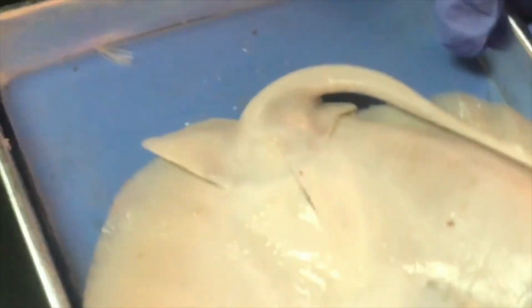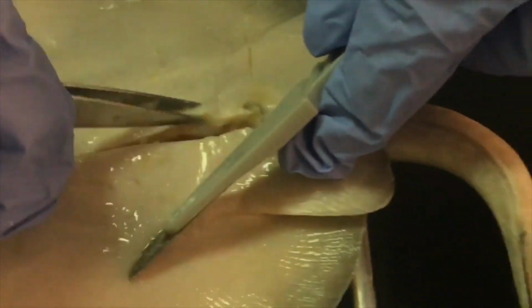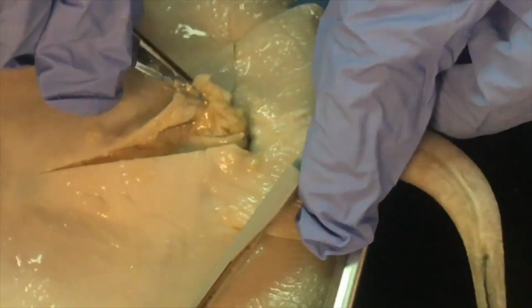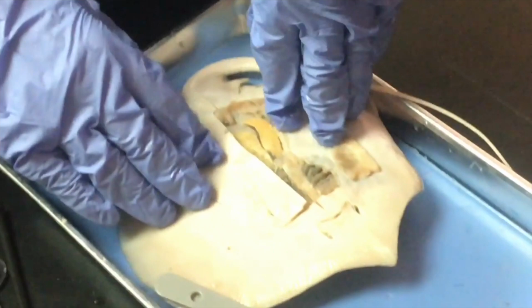Trying to squirt, but it can't really. Enough through the skin. Trying to get the... There we go. Okay. Ooh, look at that. So now I'm gonna make a incision right there. An incision. You remember. We just folded up the bottom part. Or folded open the bottom part.